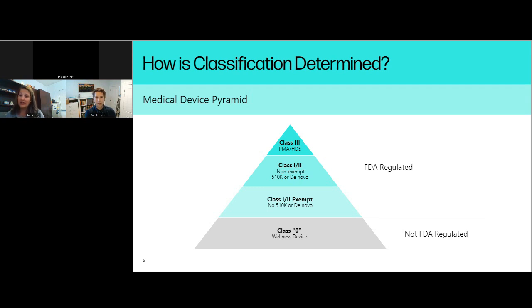And right now it's a tensile bar that is being tested for medical devices. And so one of the conversations that's happening is, given that most of our devices are used in a compression manner, does it make sense to keep testing a tensile bar that's printed to show that the mechanical properties of that batch is meeting the expectation?